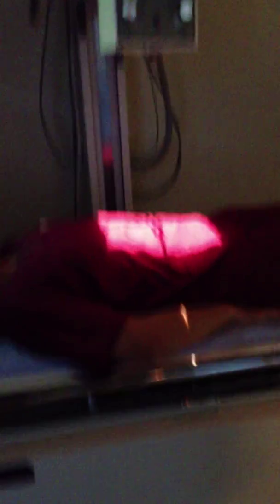His feet are perfect. Walk back over. Can you take a breath in? Blow the air out. Hold it. X-ray. And that's it — he's done. I'm going to get that right to the radiologist, read it, and get a report to your doctor.